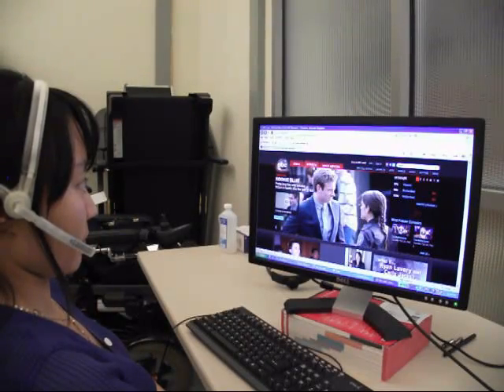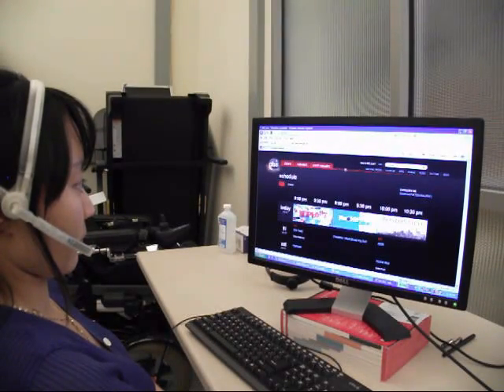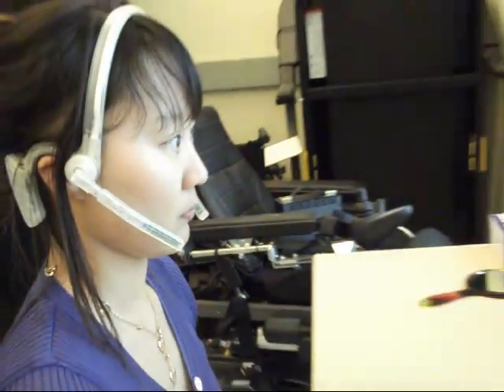Once the computer learns the command positions, she is ready to control different devices using the tongue drive system. She can use the computer, surf the internet, check and reply to her emails, and play video games.